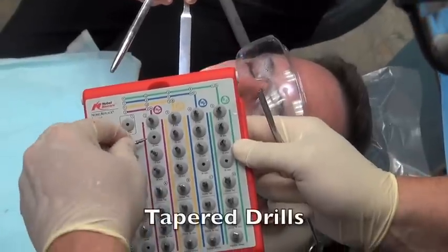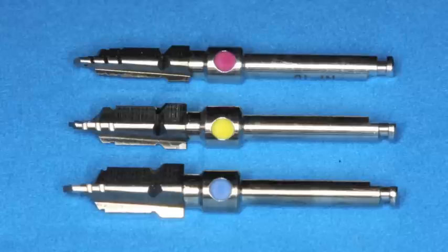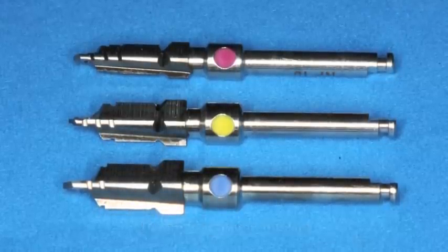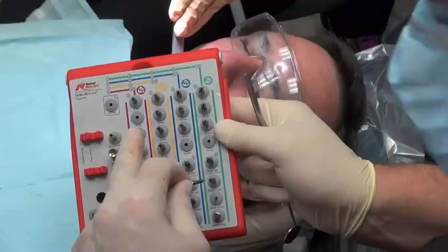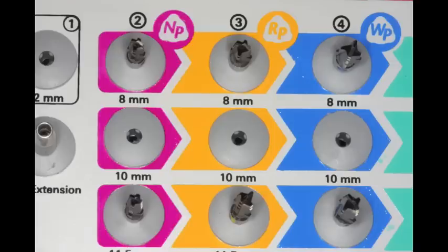After we're finished with the 2mm twist drill, we go into the tapered drills. We're going to use the 3.5mm tapered drill, the 4.3mm tapered drill, and then the 5.0mm. These are the same length, but as you go crosswise they get wider. So once you choose 10mm, you're going to move right and start choosing larger diameters based on what implant you're going to place.